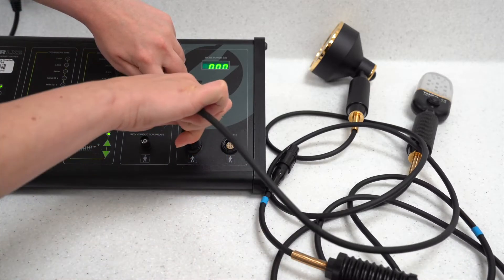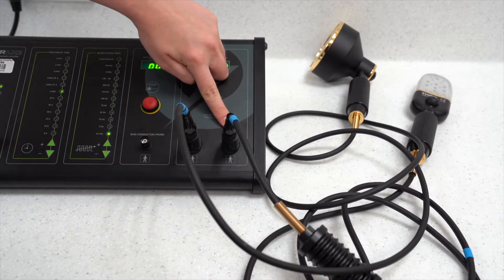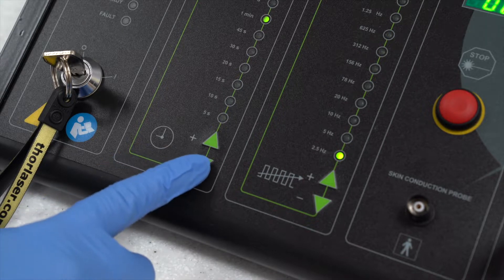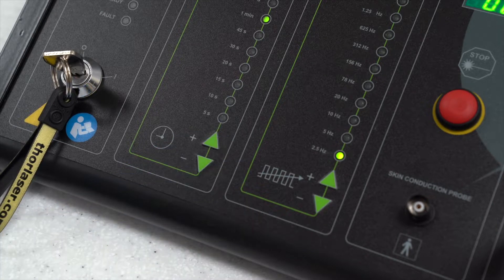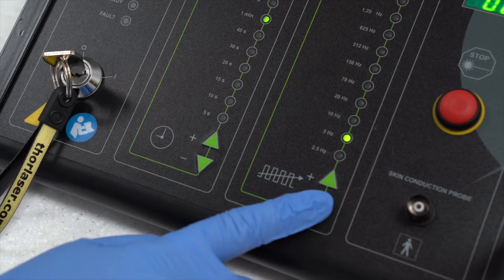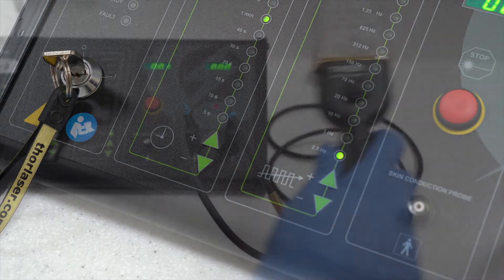Insert the probes into either probe connection. Treatment time can be adjusted using the up and down arrows. Our protocol is for one minute treatment time per site. Modulation frequency can also be adjusted using the up and down arrows and should be set to 2.5 Hertz. As long as these values have not been changed between uses, they should be preset.